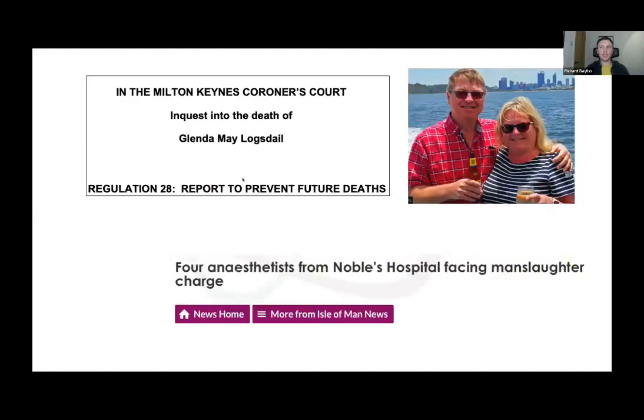And unfortunately, there are very real-life consequences from the difficulties that people have with airway management. So both of these patients died from unrecognised esophageal intubations, and in both cases, the anaesthetist thought that there was an alternative cause for the inability to ventilate the patient rather than an esophageal intubation. Unfortunately, by the time that it was recognised, there was sufficient damage from hypoxia that the situation was irrecoverable.